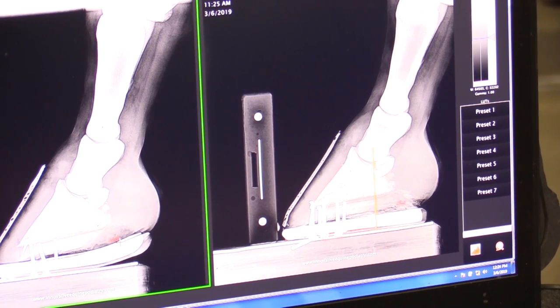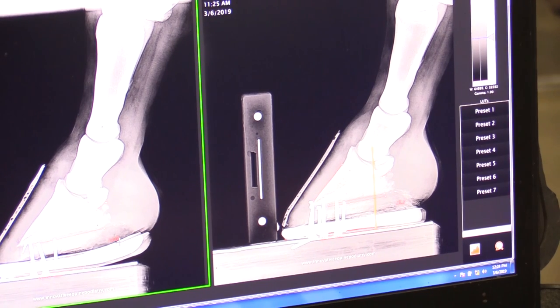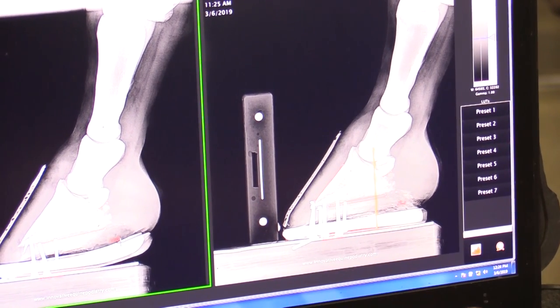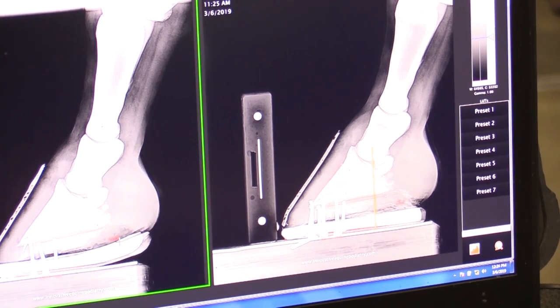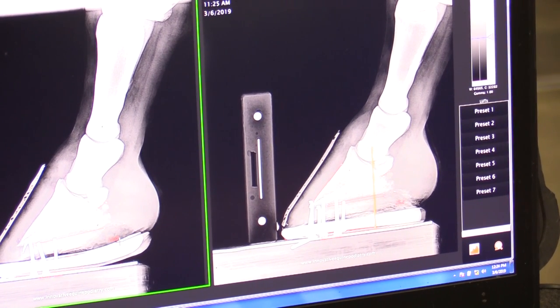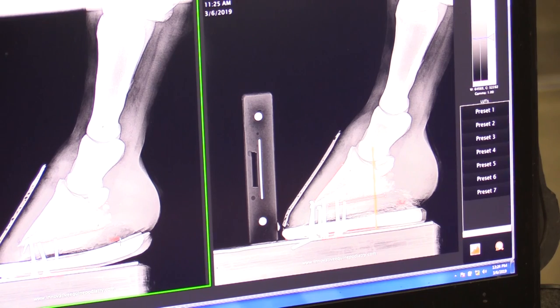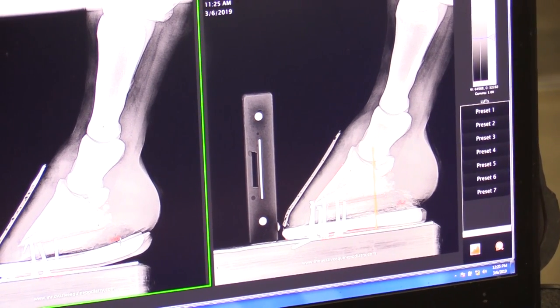And those heels are kind of folded and run in, so I'm going to get a lot of that folded horn tubules off, and then load that with that shoe. And when that rocker's back that far, you should never see that horse rock back, ever. So if you see a horse walk off and they're rocking back, then you've got to change the program. So the dynamic toe lever changed from 82 millimeters to 55 millimeters, almost a 30 millimeter reduction in leverage, just from a static standpoint, from a dynamic toe lever standpoint.